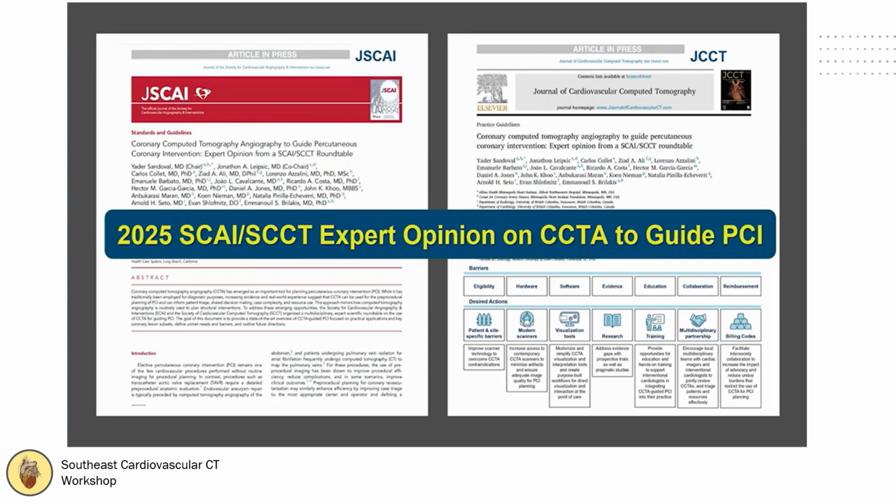This is a really important document that reflects how quickly this field is evolving. The 2025 SCAI and SCCT expert consensus highlights the growing role of coronary CTA, not only for diagnosis, but also for procedural planning and guidance. So what's happening now is that CT is moving upstream in the PCI workflow, and instead of simply identifying stenosis, we're using CT to understand vessel geometry, plaque morphology, lesion length, calcium distribution, and even physiology before the procedure begins.